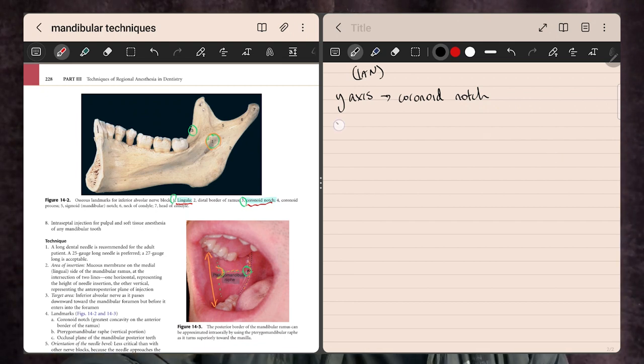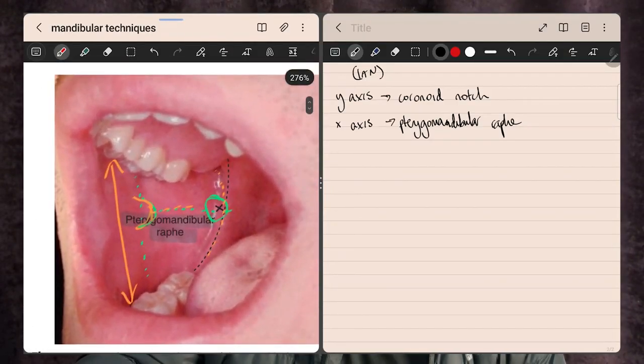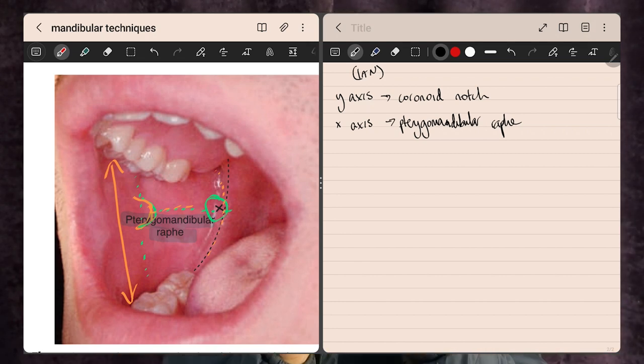The x-axis we want to come across to is the pterygomandibular raphe. You can see in the diagram it's represented by a distinct split black line — the union of two bodies of muscle with a distinct border between them. Some patients make it harder to see, especially those with a lot of cheek fat. Stretching from the coronoid notch with the mouth fully extended and retracting the cheek somewhat can help identify it more clearly. That's your x-axis; your y-axis was where your thumb was — follow across to that region and that's your target.